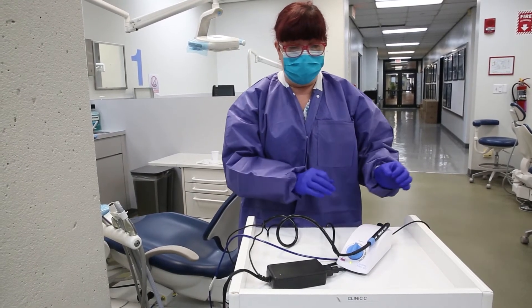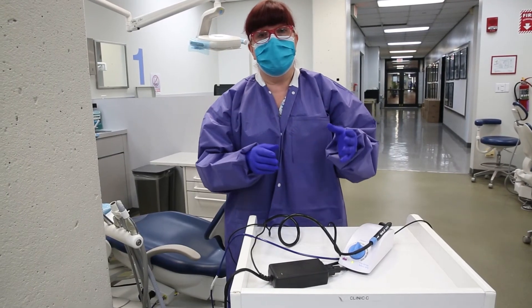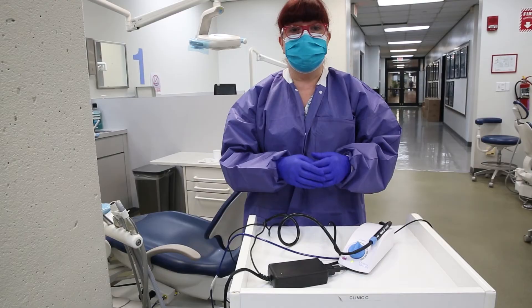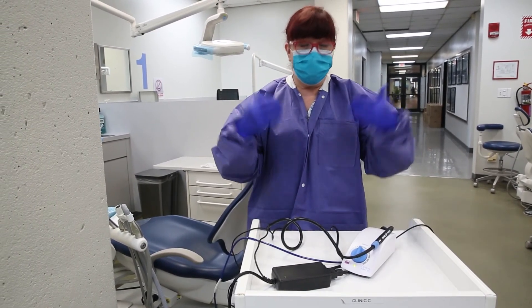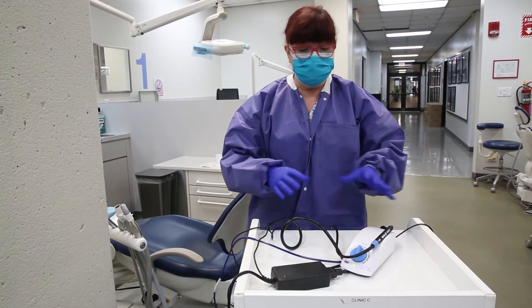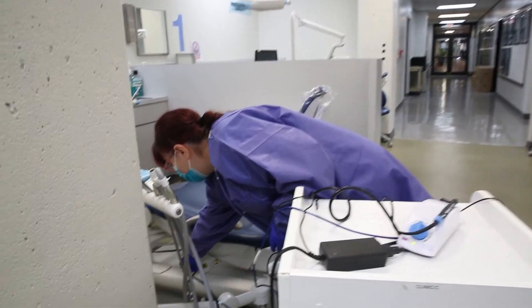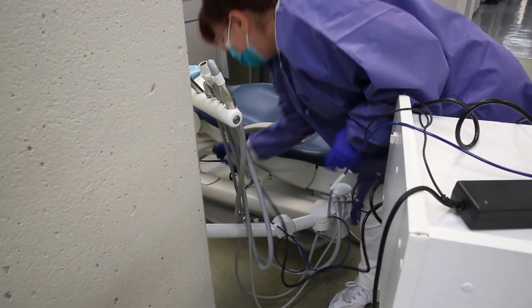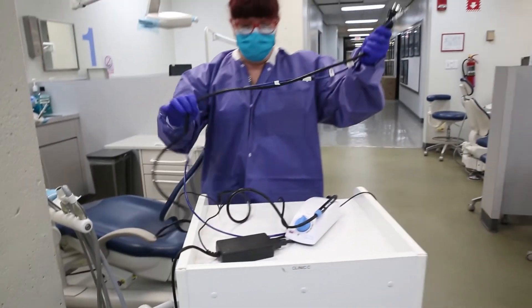You would take the insert out, put it into your cassette, clean it with a scrub brush if necessary, dry everything, put the indicator strip inside, close the cassette, and use a cassette wrap to wrap it. Wearing full PPE including utility gloves, you would decontaminate all of this, disconnect the power source, disconnect the water, and clean all the lines.